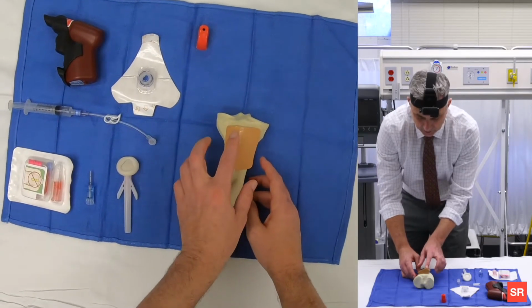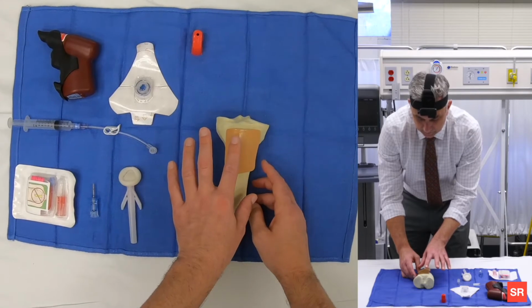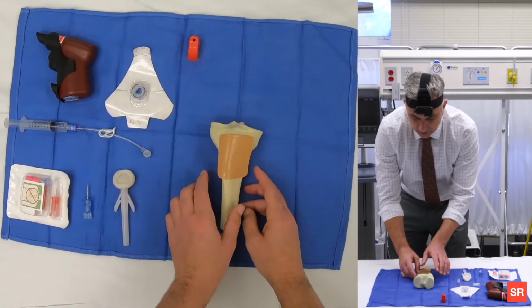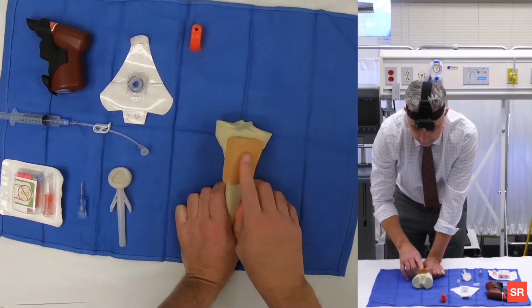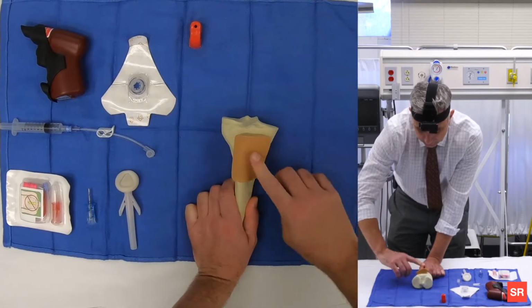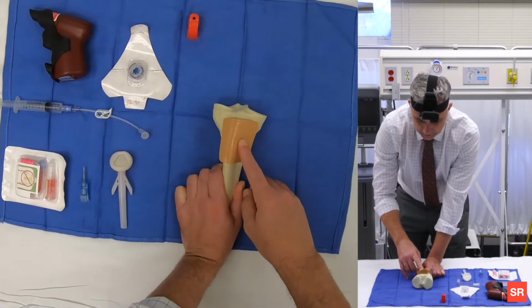In a pediatric patient, you may have to use the patella to identify the location, because it may be difficult to find the tibial tuberosity, so you may have to go a centimeter inferior and then a centimeter medial to the patella. But here it's going to be right here. So I'm going to be placing it right about there, okay? So now I have my location.